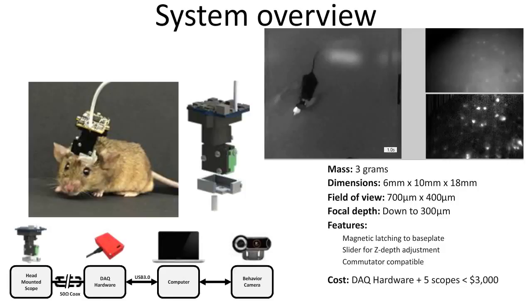The cells are imaged. Then when you're done, the animal doesn't have to go around with the microscope on its head. The microscope will come off and the animal will go back. The great thing is the microscope can go back the next day or the next week, and the same exact group of cells are imaged. And this is all interactive with the behavioral camera.